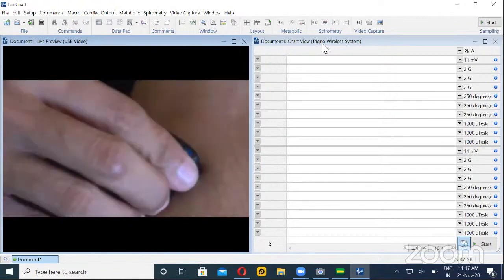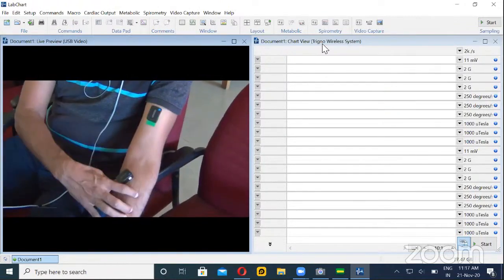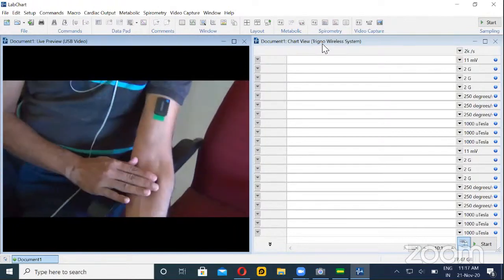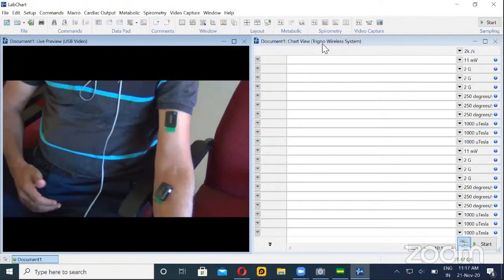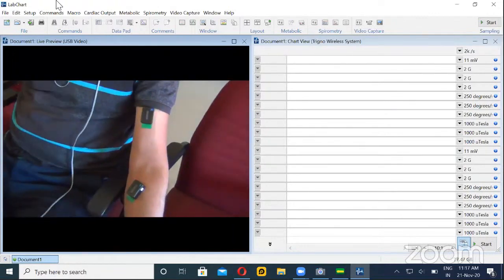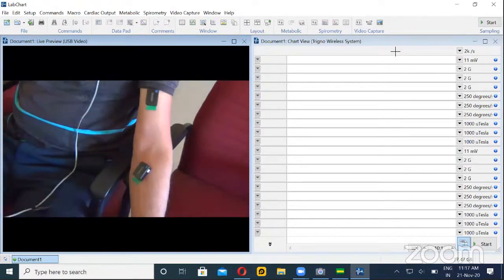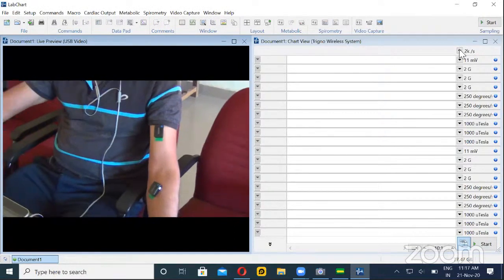The second sensor I'll put on my wrist — I think it is the pronator quadratus muscle. Since this is in a diagonal position, these two muscles are attached, and you can attach it to whichever muscles you are planning to investigate.